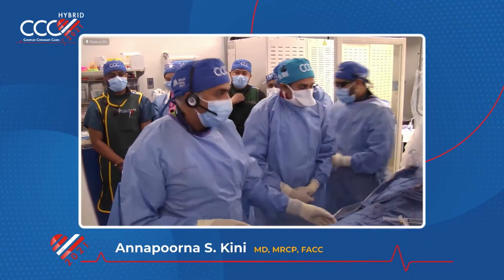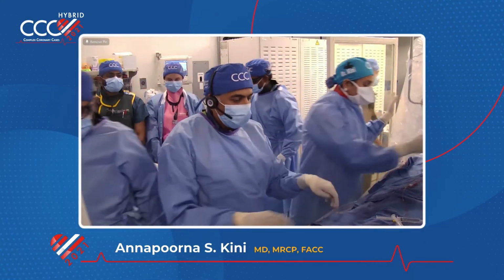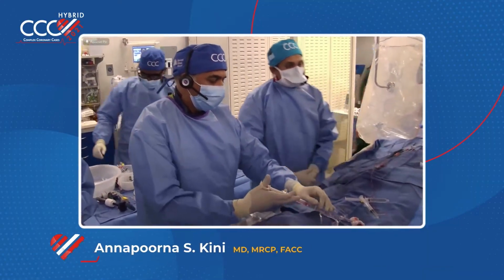So as you see how we are able to do all these complex cases, it's because these guys are well trained and they know exactly what to do. Just with my eyes and my finger movements, they know what they have to do.